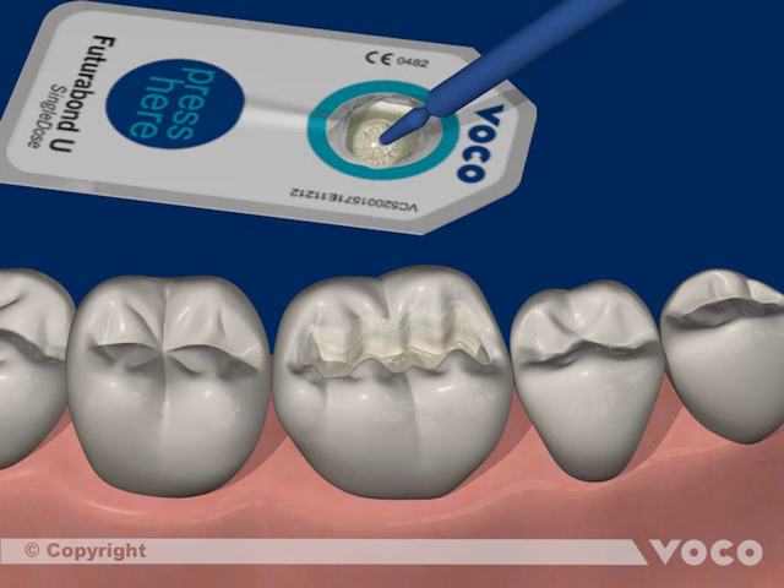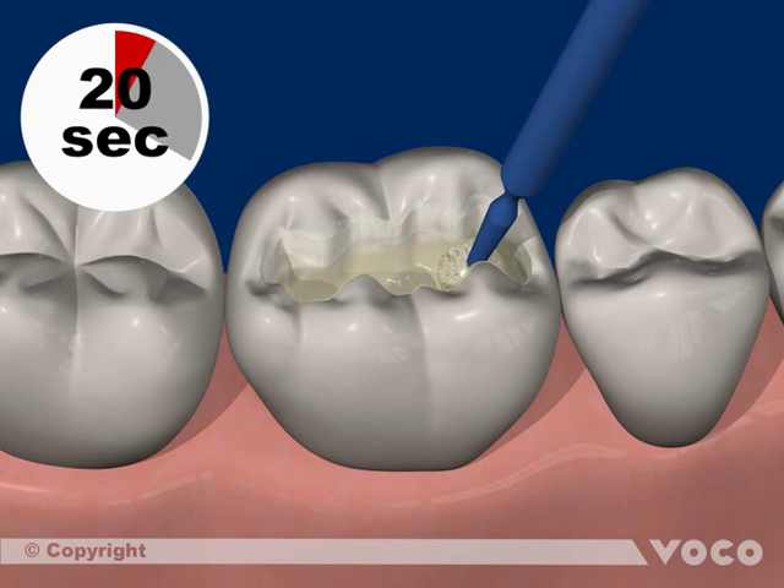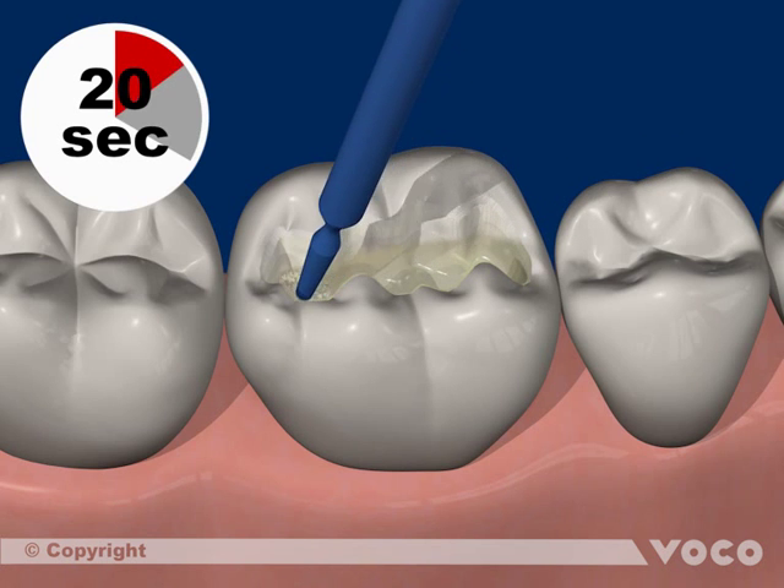After activating the single dose blister, Futura Bond U is applied evenly to all cavity surfaces with an applicator and rubbed in for 20 seconds.